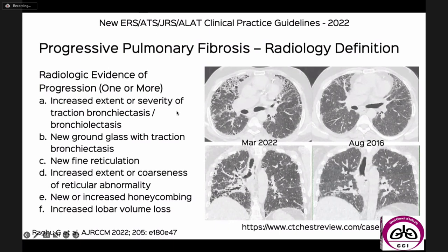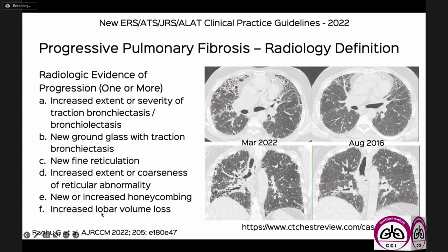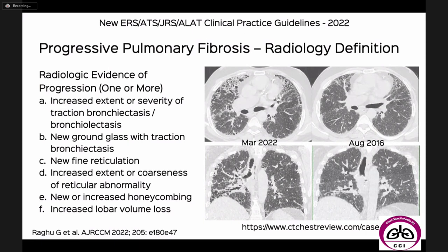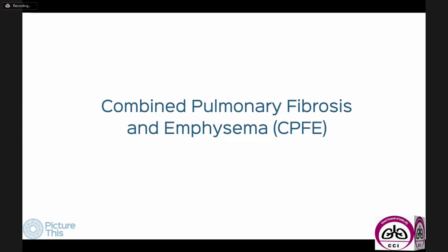The three categories of ILA are: non-subpleural ground glass, subpleural non-fibrotic reticular opacities, and subpleural fibrotic reticular opacities with traction bronchiectasis — all incidental findings in patients scanned for other reasons. A recently defined entity by the ERS/ATS in 2022 is progressive pulmonary fibrosis: if we have two scans at least a year apart and see increased traction bronchiectasis, new ground glass, new or increased reticulation, we use the term PPF.